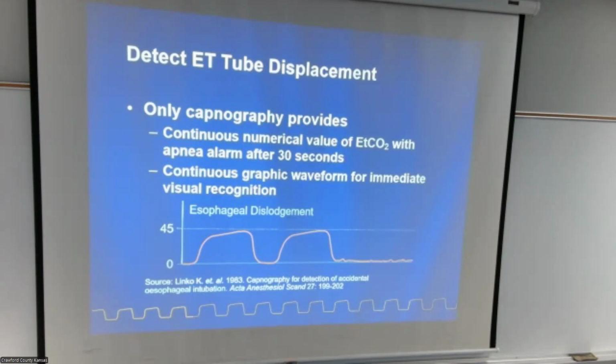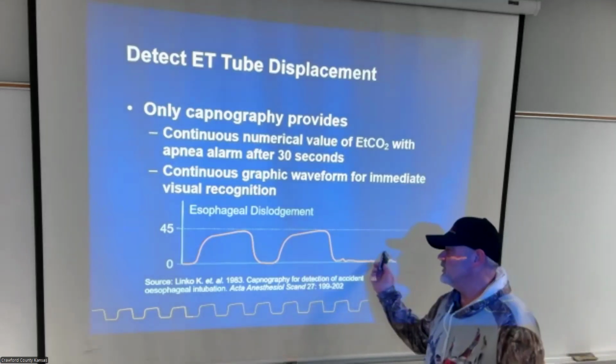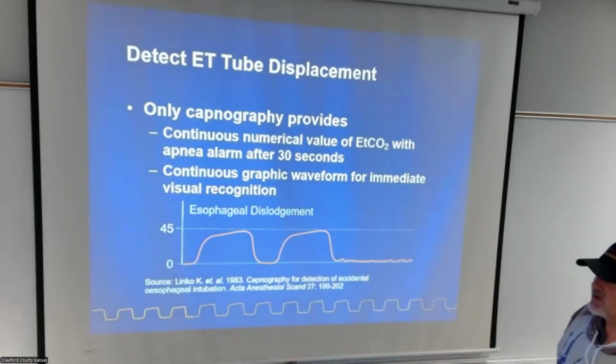Capnography provides a continuous numerical value of the end-tidal CO2 with an apnea alarm after 30 seconds. Continuous graphic waveform for immediate visual recognition. This is why we want the screen up here. Numbers are great, but you want to see the waveform. The waveform tells you so much more than what the numbers do.